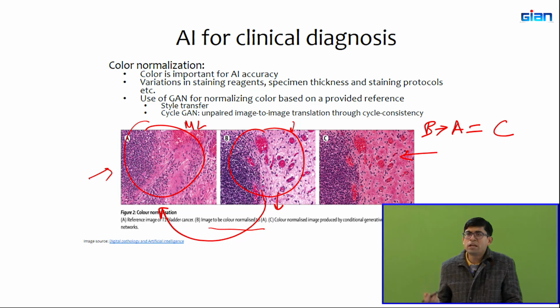So even while training, a lot of times you don't have data from a single site, you have data from multiple sites for training. And we saw this yesterday, where I told you that for the COVID-19 case, when we trained a model on Stony Brook and tried to test it on data collected from Rutgers, it didn't work. And when we went back and looked at the X-ray images, we saw that the intensity profiles were different. Now, let's say that we want to train a model together. So we can obviously take Stony Brook data and Rutgers data, put them together and train a model.